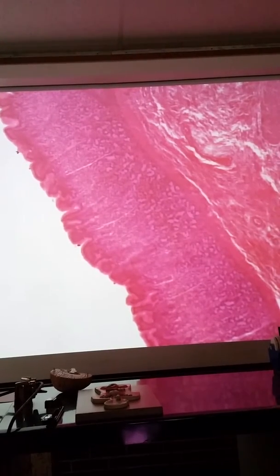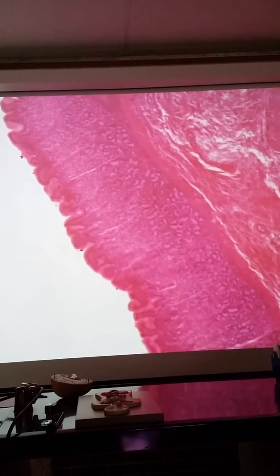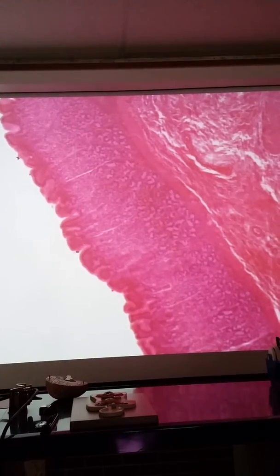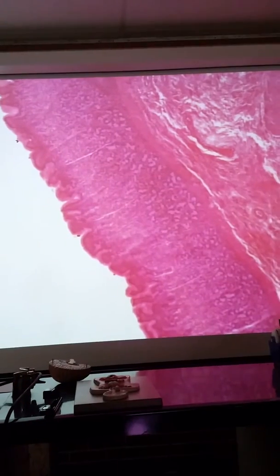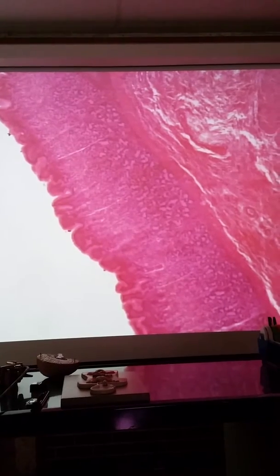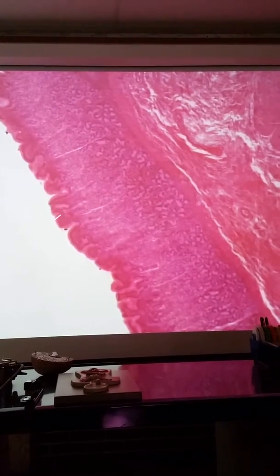In 203 we talked about tissues, we did epithelial tissue. The lamina propria is going to make it all moist, squishy, a lot of space in between, so you can get a lot of cells in there. So with something like that, that's part of the mucosal layer. So now I talked myself out of that. We're going to take off lamina propria, mucous membrane, and just put mucosal layer. That all together makes up our mucosal layer. So that's what we're going to stick with. We're going to stick with the layers. So mucosal layer.